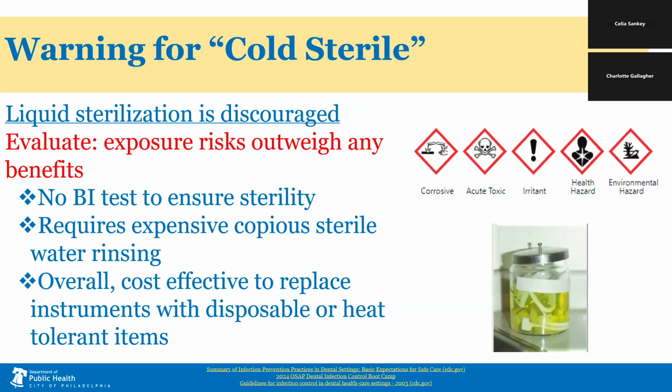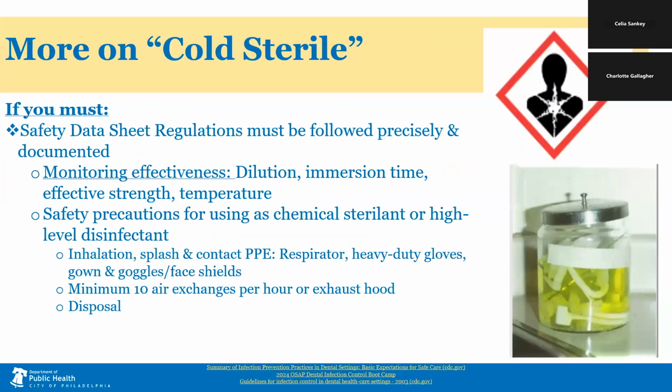Now, a special consideration about cold sterile. Some offices are still using glutaraldehyde or cold sterile solutions that are high-level disinfectants. Their use is discouraged because health risks outweigh benefits, and it's actually cost-effective to use heat sterilizable or disposable instruments, because cold sterile instruments need to be rinsed copiously with sterile water to prevent chemical exposure to patients, and even then sterility cannot be verified or maintained.